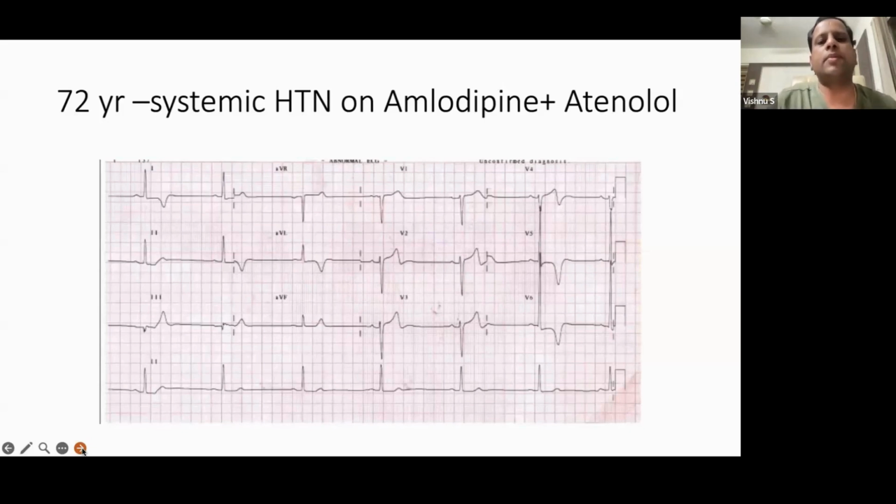Most patients will be asymptomatic. That's why missing a bradycardia will not be a problem in the initial phase. But if the disease progresses, patients will present in a later unstable state. Does anyone volunteer about the findings? In the first case, we will go systematically one by one, as it goes in a bradycardia case. Then we will go fast with the diagnosis.